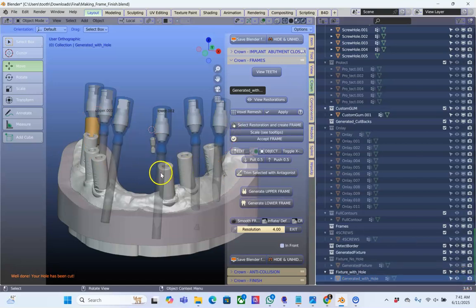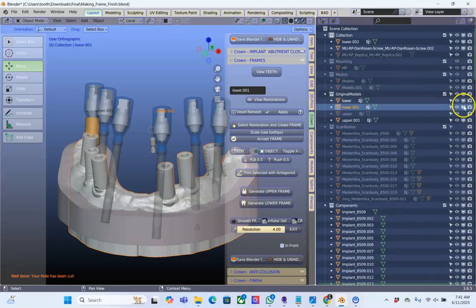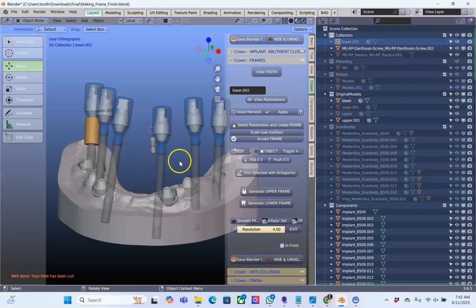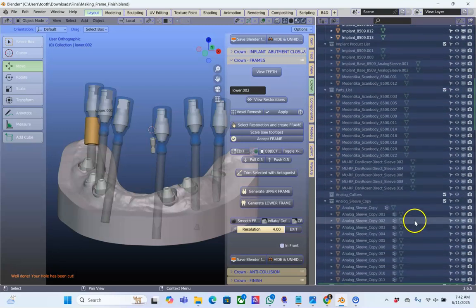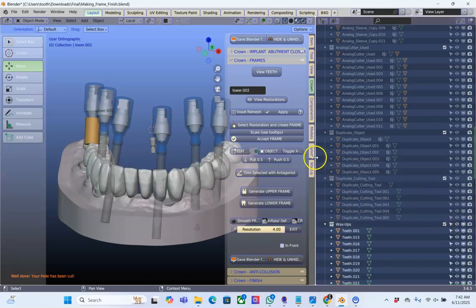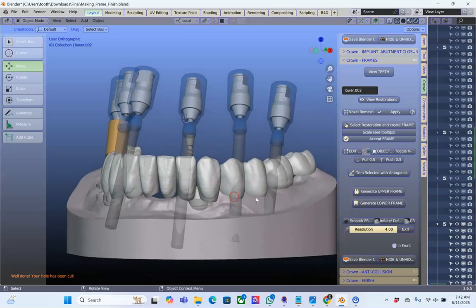Okay, so we've got the scan body scan. I don't need that either. But what I do need is a model underneath it. This one I need. And I need the tooth library. There's a wax up here. Great. Now, I have noticed that the library is open.